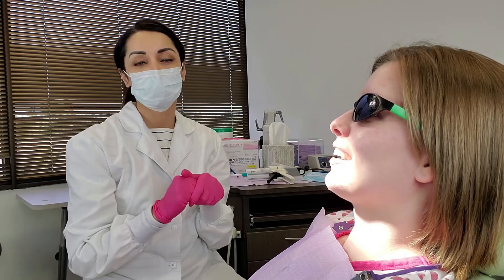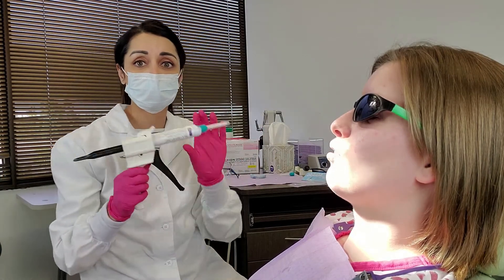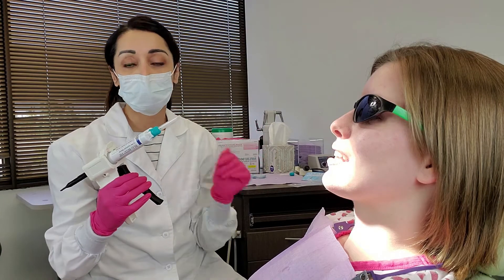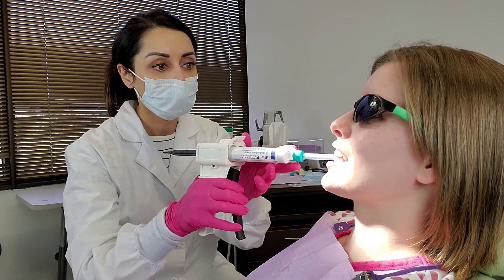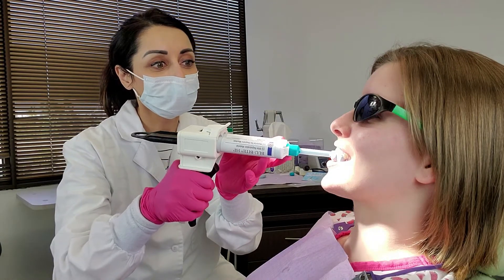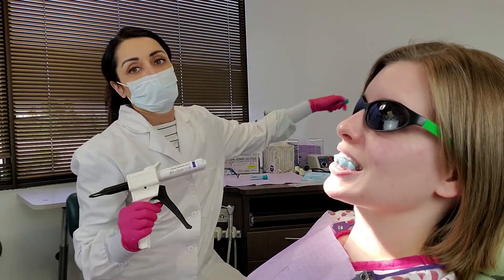Now 20 minutes has gone by, so we'll go ahead and take the first part of the bite. We do this in two steps. I'm using the blue bite registration material, and you definitely want to have two fresh tips for this part. We leave the Aqualizer in and insert the material, typically canine to canine, wherever the Aqualizer is not resting between the teeth. We'll let that set for about 40 seconds, and while it's setting I'll switch out the tip.